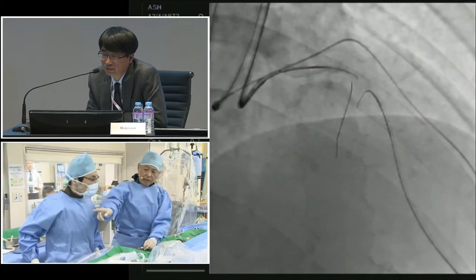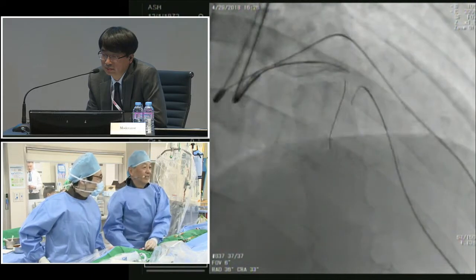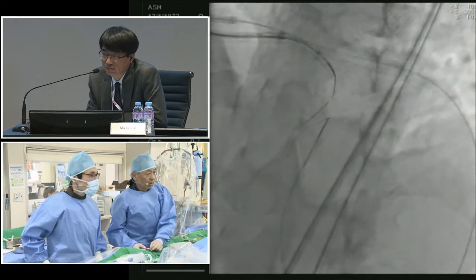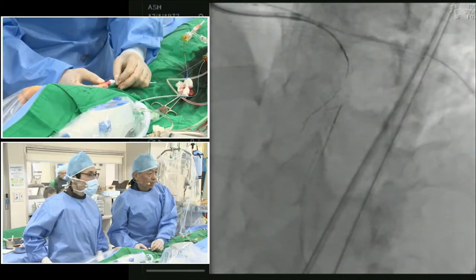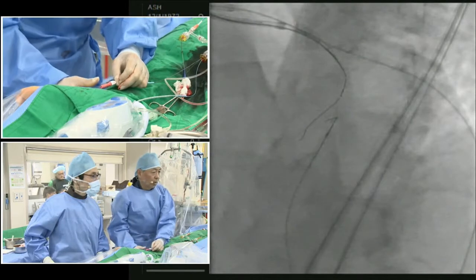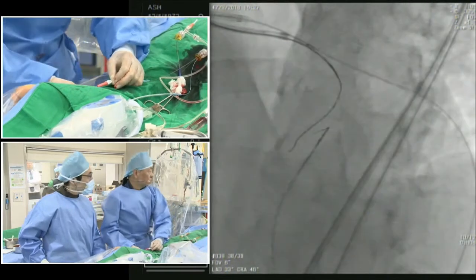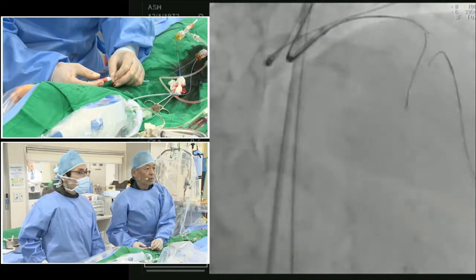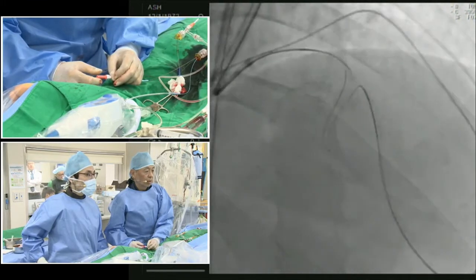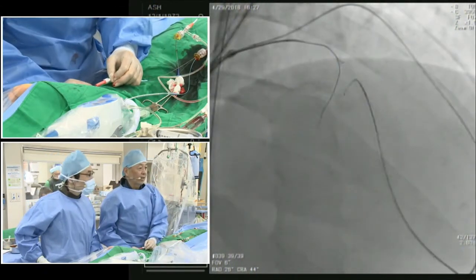Okay. Looks good. Store. Okay, please pray. Come on. How about? Okay, looks not so bad. Probably turn to the diagonal direction. Okay. Store. Okay, back to cranial. Come on. Store. Okay, again. This is Gaia, so easy to go out.